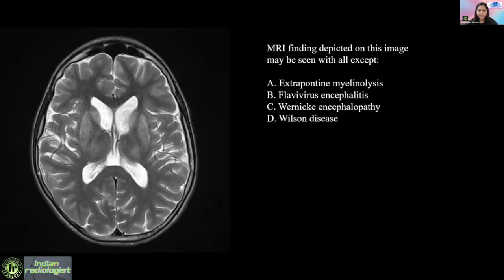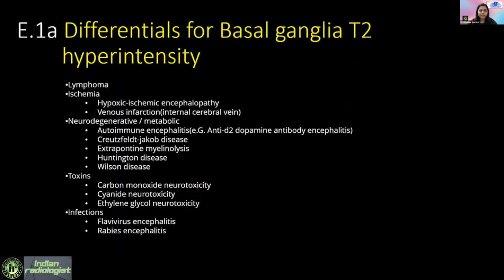37 percent chose option C, and there is a divide. The answer is C. It can be seen with extra-pontine myelinolysis and flavivirus encephalitis, but this appearance of T2 hyperintensity in the basal ganglia is not common with Wernicke's encephalopathy. The differential list for T2 hyperintensity in basal ganglia includes ischemia, hypoxic-ischemic encephalopathy, venous infarction, autoimmune encephalitis, CJD, extra-pontine myelinolysis, and toxins like carbon monoxide, cyanide, and neurotoxicity.